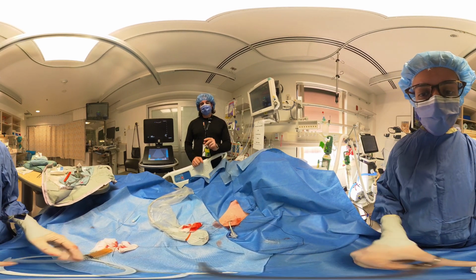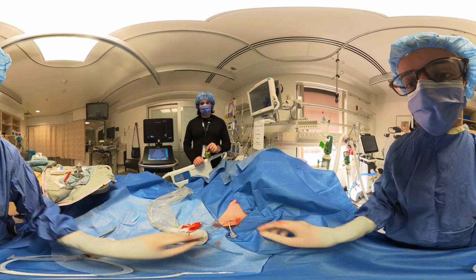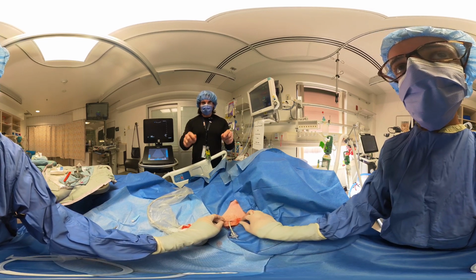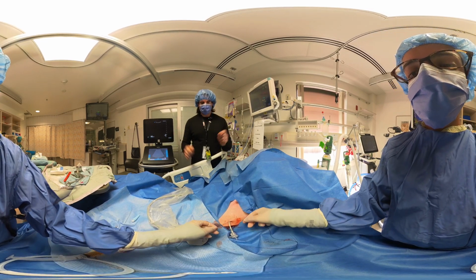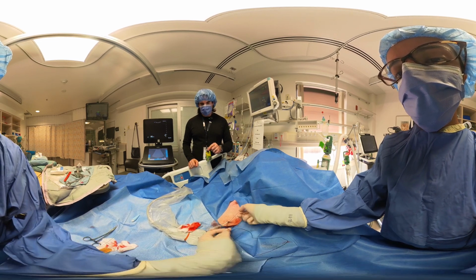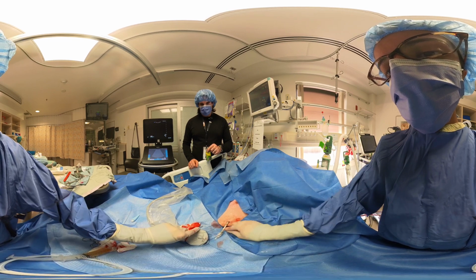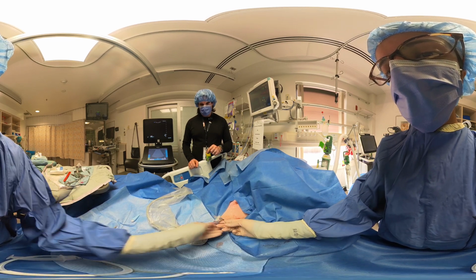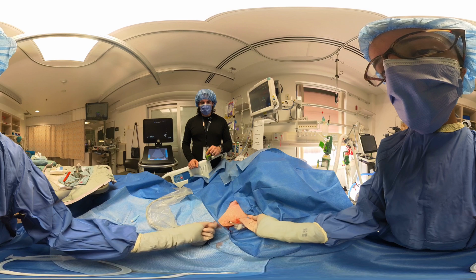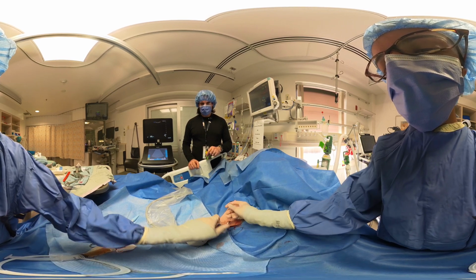Now we're going to tie. So now that we've sutured to the skin, now we're going to suture to the chest tube itself. So let's suture that to the tube. What I'd recommend is, you know what a Roman sandal is? Mm-hmm. So around the tube with both, and come around the tube again. Other side. Go around again. Okay. And tie one knot. Okay, so if you can tie a knot there.